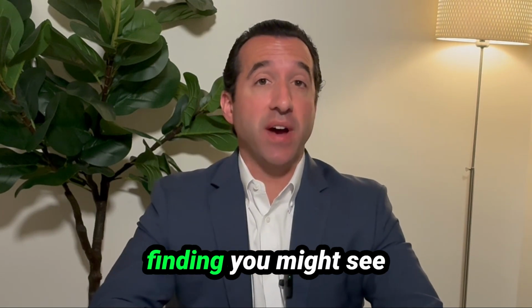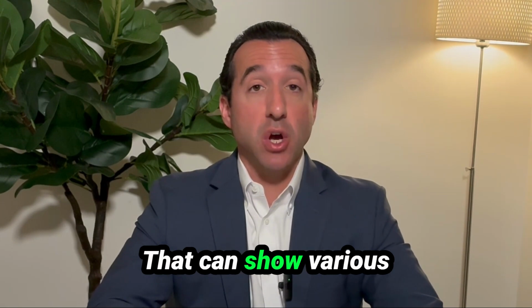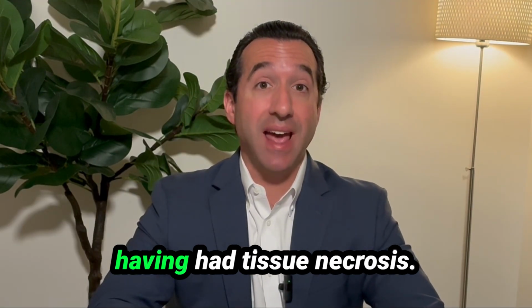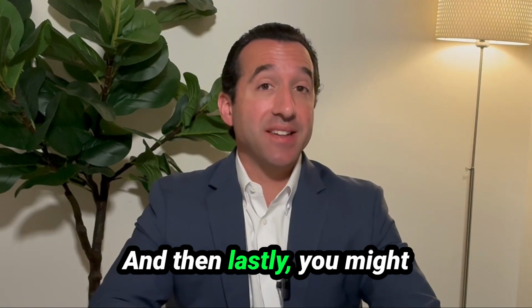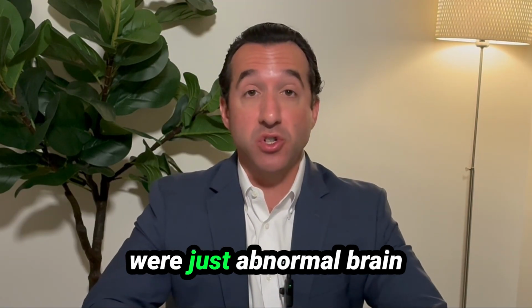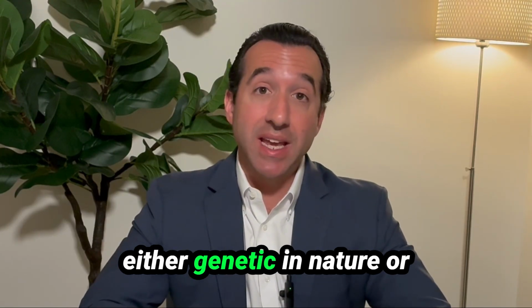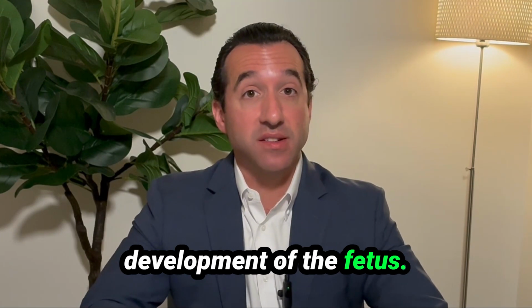Another type of finding you might see is a neonatal stroke that can show various different parts of the brain being affected and having had tissue necrosis. And then lastly, you might see on an MRI cortical malformations, which were just abnormal brain malformations that are either genetic in nature or occurred early on during the development of the fetus.